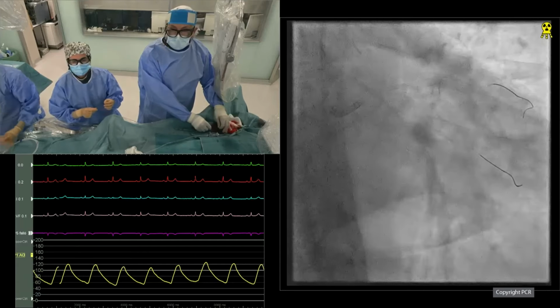So then, did you make a bend in any of the wires? I guess, Florim, this is not yet. Nothing surprisingly. I mean, it can happen in this kind of procedure that we might have some slow flow in the LAD, which is partly explainable perhaps by the effect of the ablation there. This is not entirely unusual when you are doing atherectomy in patients that have extensive disease, etc. You have to be ready to handle it, and no rush.